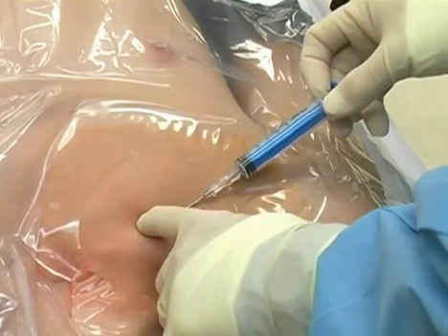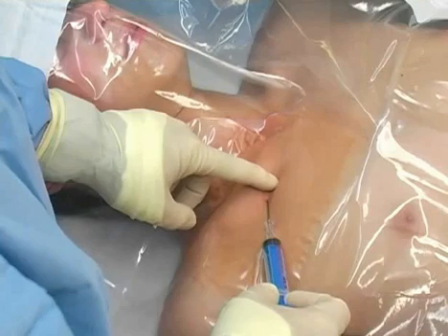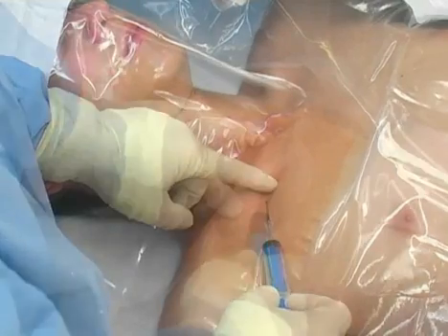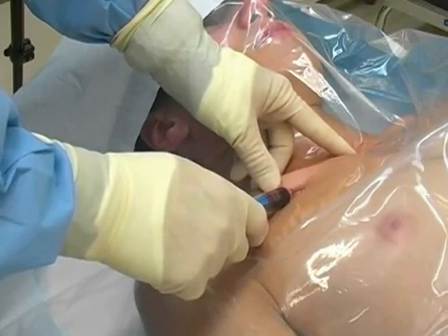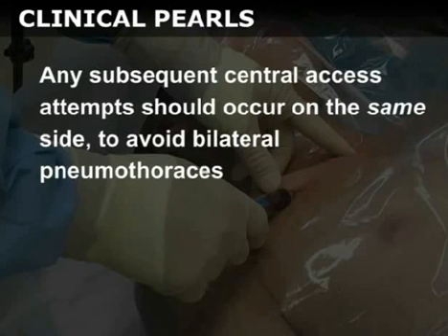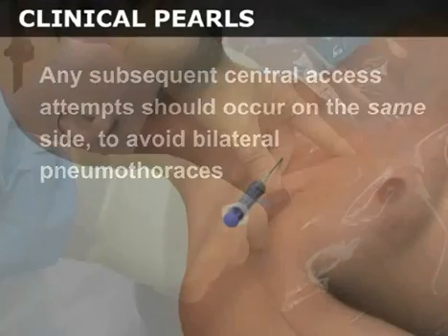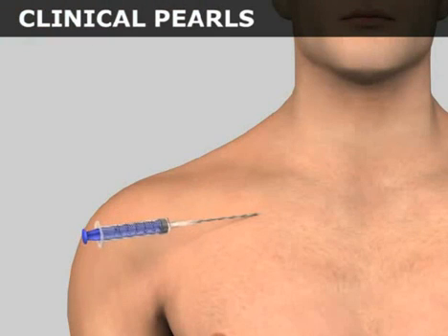It may be helpful to push down on the needle with your non-dominant hand to guide it toward the posterior surface of the clavicle. Pull back on the plunger as you advance. Entry into the vessel will be heralded by return of free-flowing dark venous blood into the syringe. If air is aspirated, the pleura has been violated and the patient should be evaluated for pneumothorax. Any subsequent central access attempts should occur on the same side to avoid bilateral pneumothoraces. If no blood is encountered while inserting the introducer needle, slowly withdraw it while continuing to aspirate. If there is no blood return, withdraw the needle, aim more cephalad, and try again.